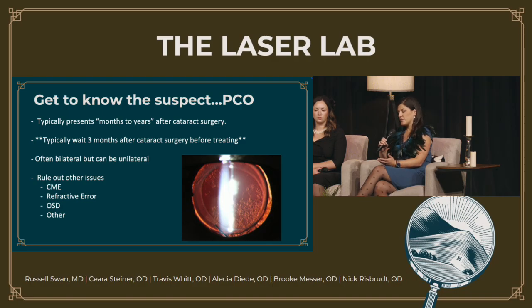But on the evaluation, I certainly want to make sure that their dilation gets large enough. So I'd really like to see their pupil get past the capsular rhexis, because then I know that Dr. Greenwood is going to have a really clear view to the back to make sure that he can get a nice wide opening there with the laser.